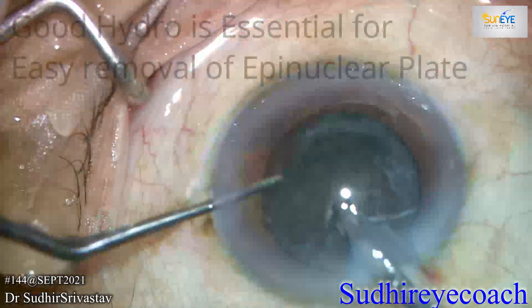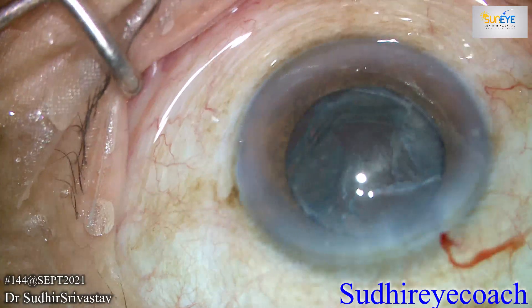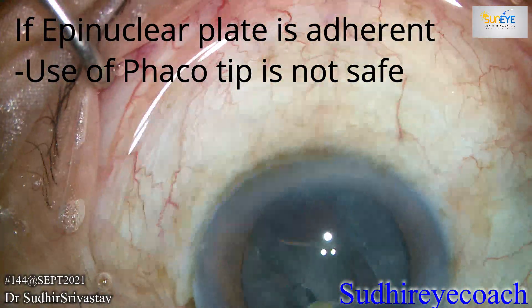If your hydro procedures are okay, then removal becomes quite easy. You can aspirate the epinuclear plate and cortical material easily, even with the lower settings through the FACO tip.